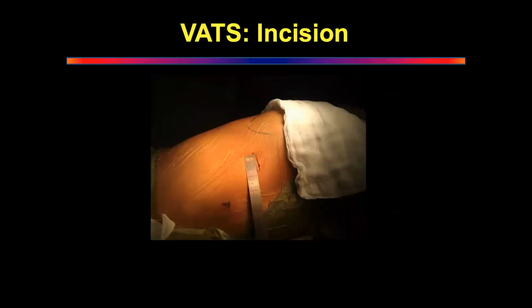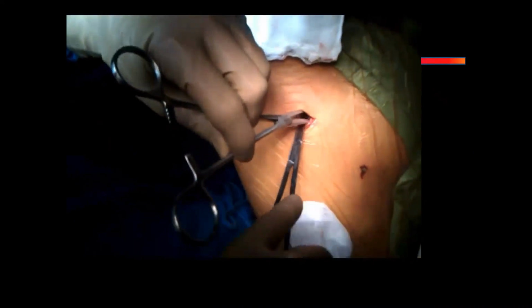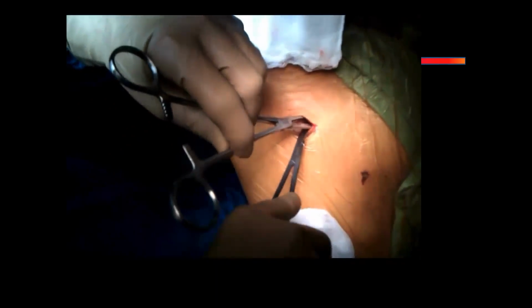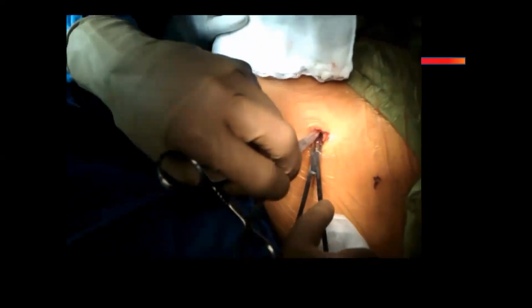So you make your incision and then you do this dissection. I personally teach all my juniors to use splitting instruments rather than one instrument, and it has to be a splitting of the muscles rather than pushing your instrument in. Can you see that? Yes. So it has to be splitting of the muscle. Okay. So once you have, see, my left hand is the guard.